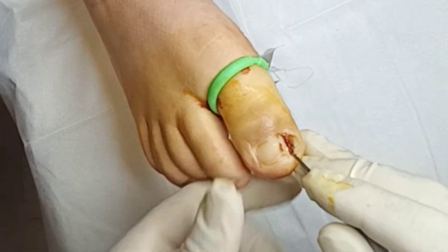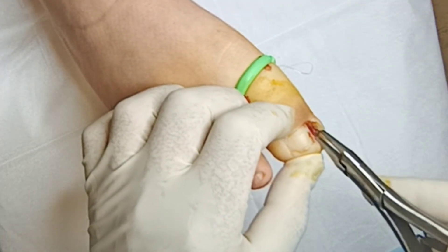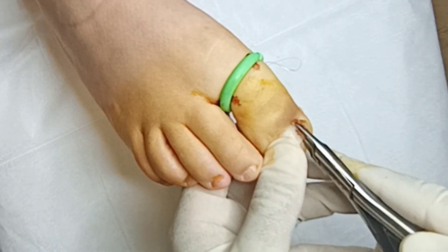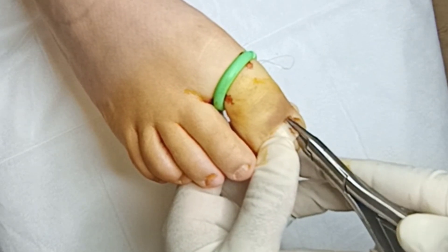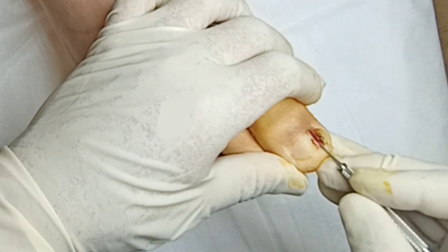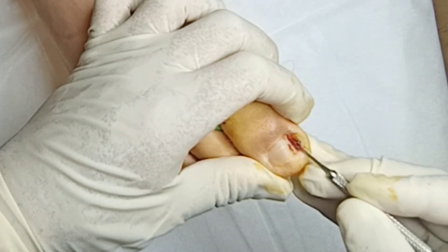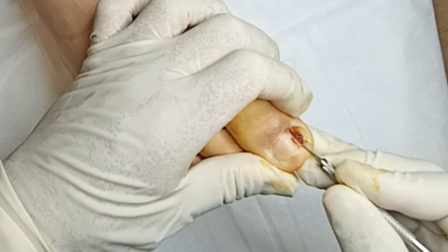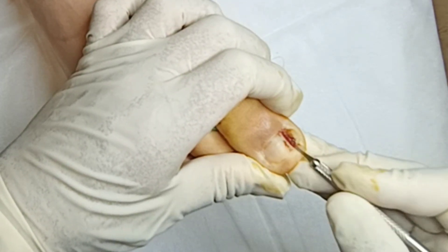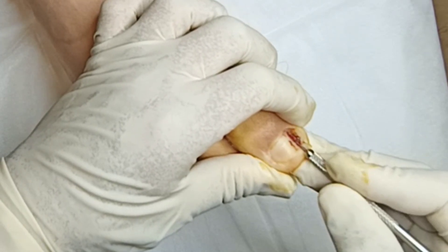Blacks file — we separate the nail from the nail bed. Then we come in with our nippers. You don't have to take off too much; a lot of people end up taking half or a quarter of the nail. Only go to the area where the matrix ends, maybe a millimeter or two in — just enough to clear that nail from the sulcus. So we clip and we pull out. Then we come in with our beaver blade. We cut along the nail, use that cut as a guide, and go all the way under the matrix, cutting through all the way to the end. Making sure the line is nice and straight and clean.